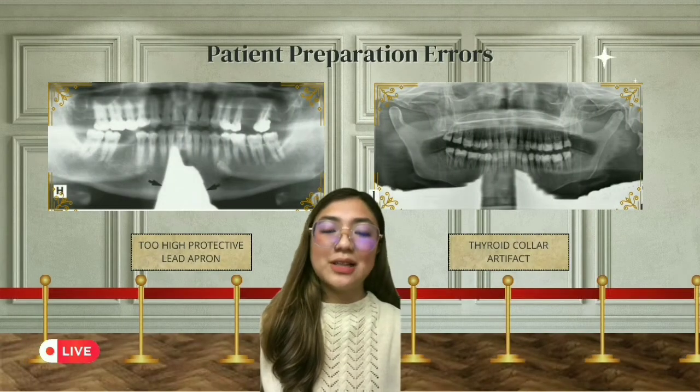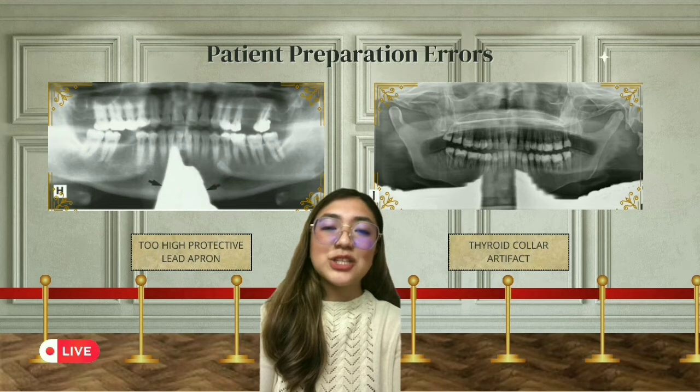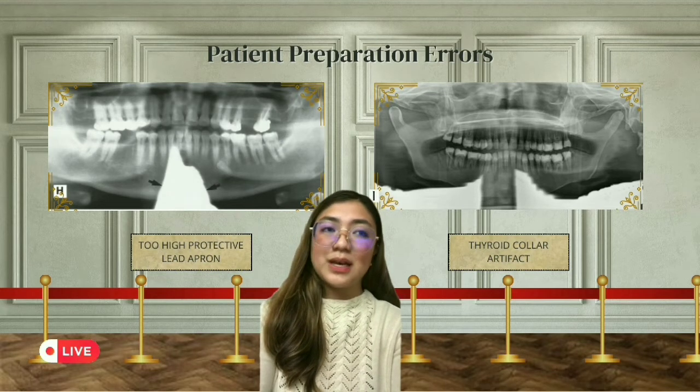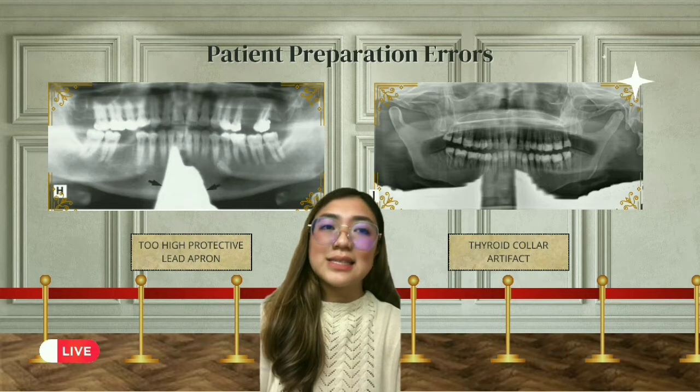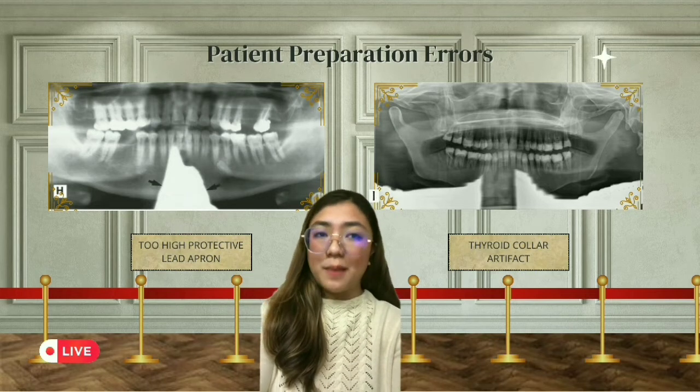We now head to the last portraits of the patient preparation errors. Exhibit H shows inappropriate use of the protective lead apron. This is too high on the neck, casting a dense radiopaque shadow, as arrowed, over the anterior part of the mandible.